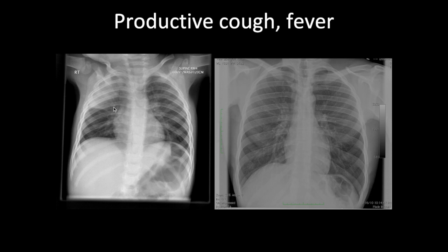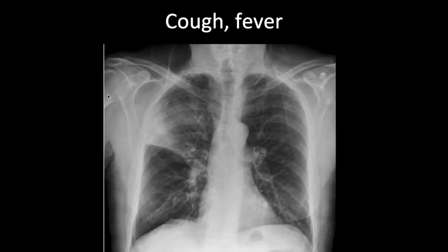This child has consolidation in the upper lobe of the right lung. There are no lung markings in the right upper zone, no air, and no evidence of volume loss — so this is consolidation. You can see an interface here with the horizontal fissure confirming it is in the upper lobe. Here is a small area of consolidation, again in the upper lobe — you can see the horizontal fissure. No lung markings in this area, no air, no volume loss — this is consolidation.